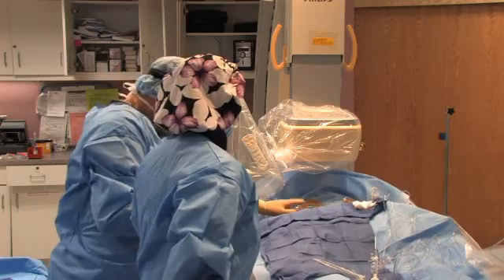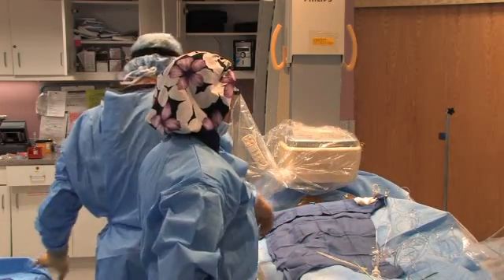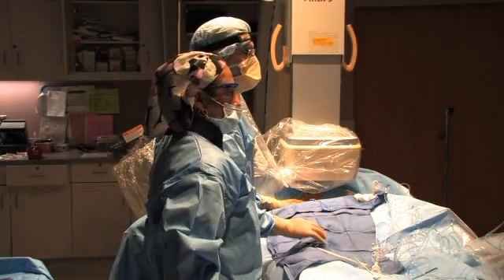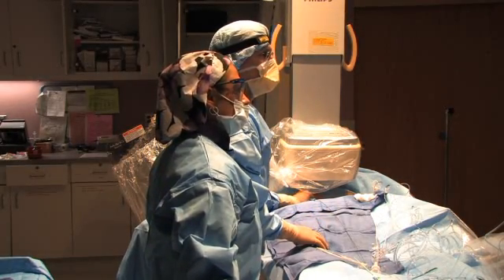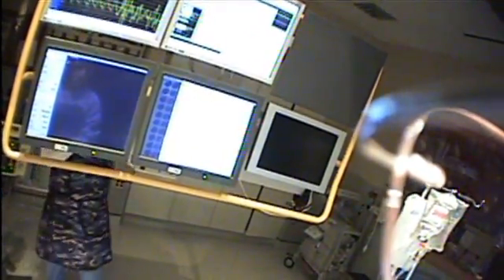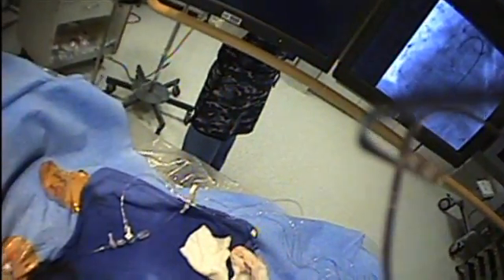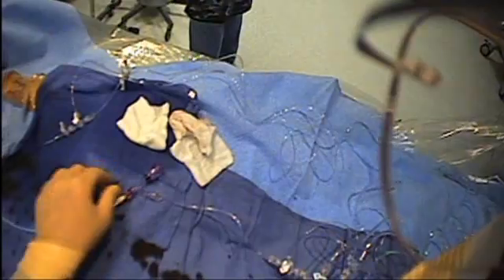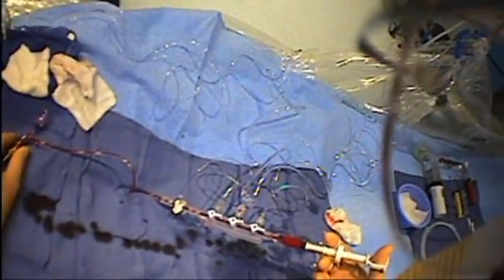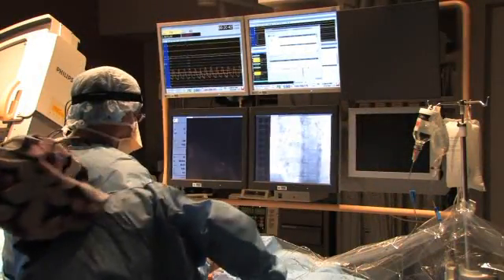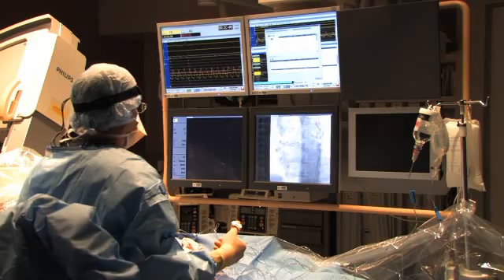We're using an instrument here under fluoroscopy to find the perfect spot to enter. You can see on the screen here — this is a wire that has gone up the aorta and down into the ascending aorta. Over that wire we've placed a guiding catheter, through which we'll place our angioplasty equipment. Now, looking up at the screen, I'm filling the catheter with contrast.